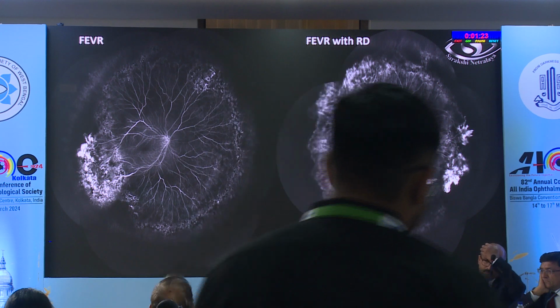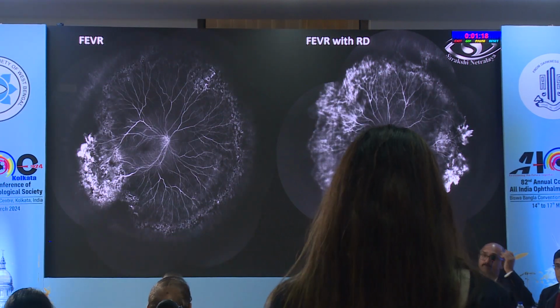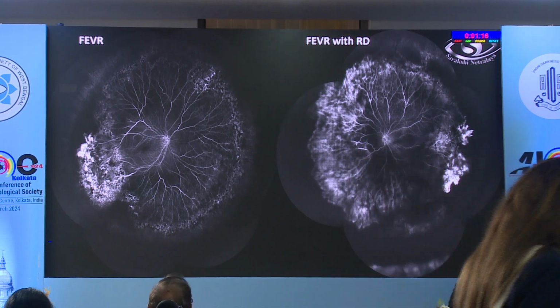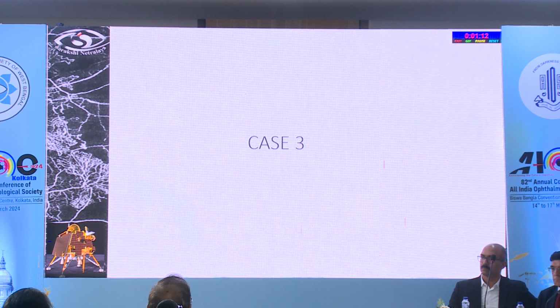So importantly, we treated the better asymptomatic eye with a laser and averted a disaster which had already happened in the left eye. Of course, we operated the left eye, and this is the post-op photograph of the same patient.